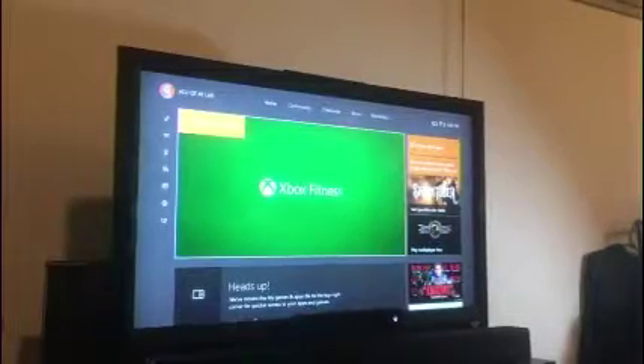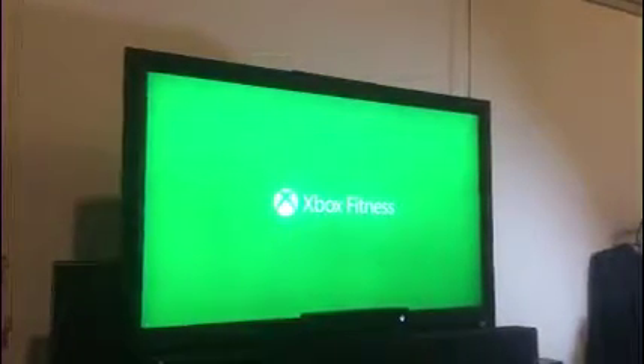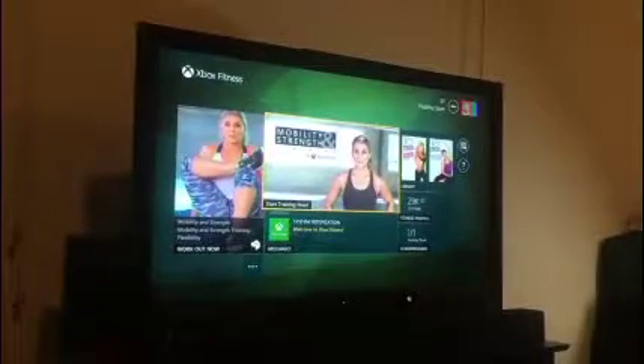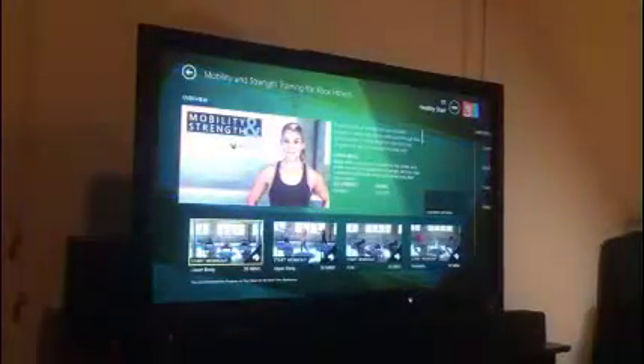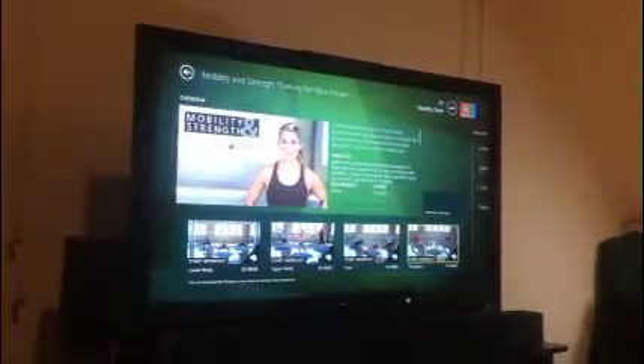Select Xbox Fitness using the A button. Select the game you would like to use. For this example, we are selecting mobility and strength. Next, select the areas of skills you would like to work on. We are selecting flexibility.